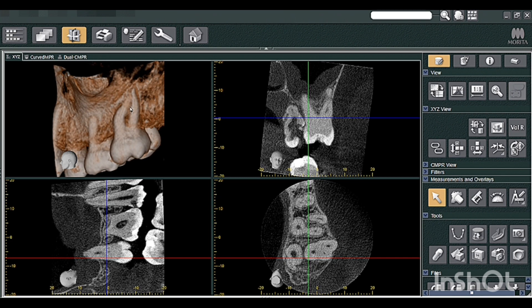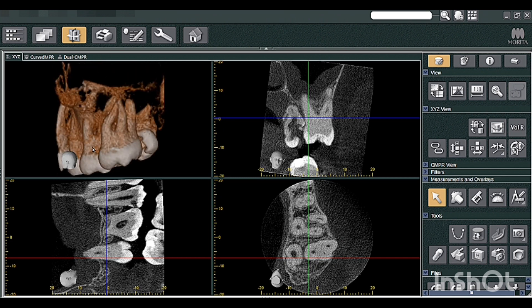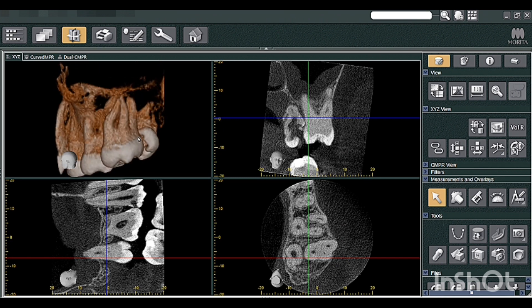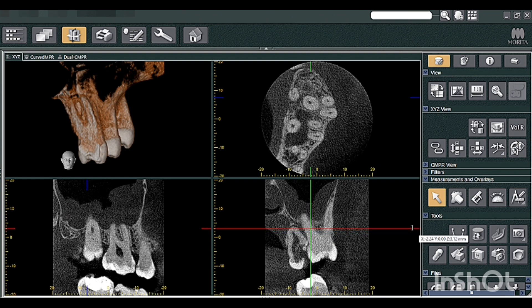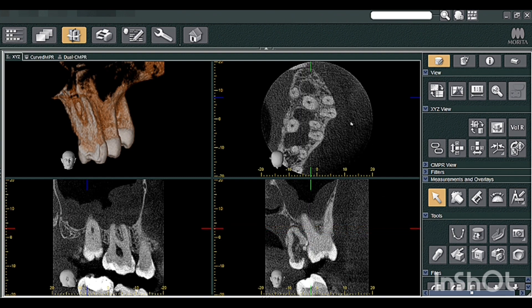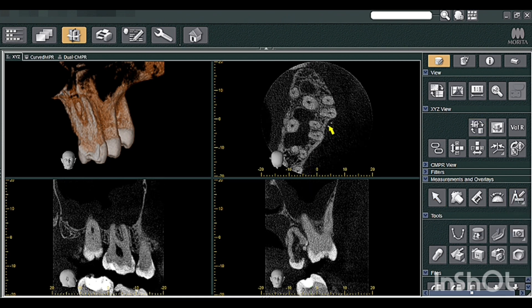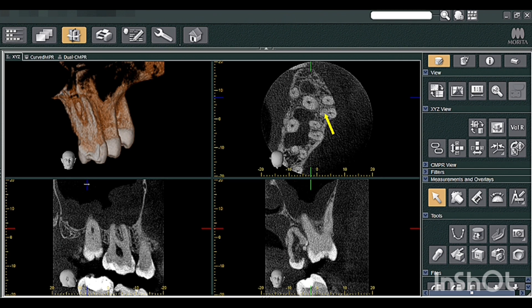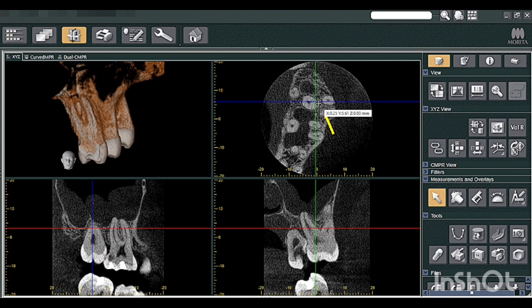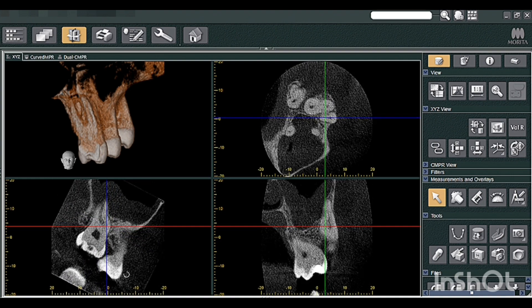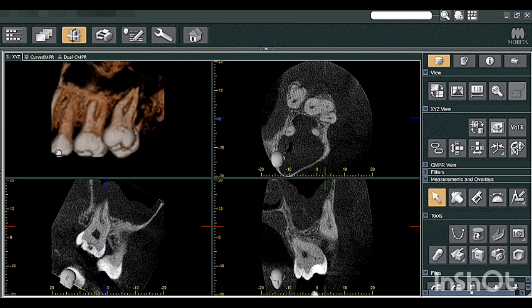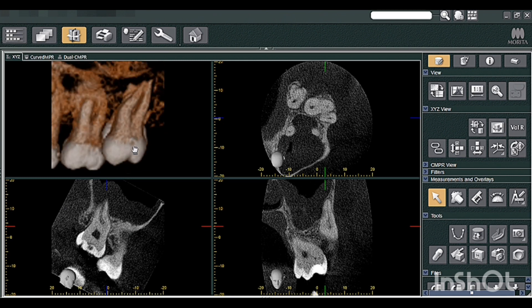You can also check out the root anatomy of 27 — the buccal root anatomy, palatal root, curved disto-buccal root, and curved meso-buccal root. This will help the dentist for root canal study — you can check the number of canals and whether the MB2 canal is present. Going from coronal to apical region, there is no clear evidence of MB2 canal, but as you can see over here, this thing could be the MB2 canal of 27. Since the mesial root is curved, the endodontist has to curve the file and perform biomechanical preparation.